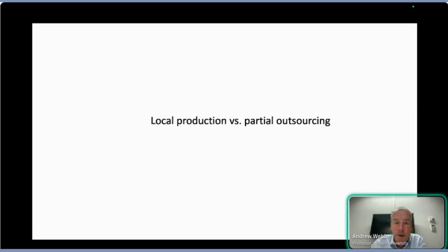So we have to think a little bit about this idea of local production versus at least outsourcing part of these systems, because ultimately there are two aims. One, of course, is to learn about how to build an MRI system, and that's very, very valuable. But the other is you have to have a system which is working reliably, which is starting to produce clinical data, because we still need to convince a lot of local clinicians that this approach is really useful. And they'll only see that if we get the highest quality images and we get them every single time.